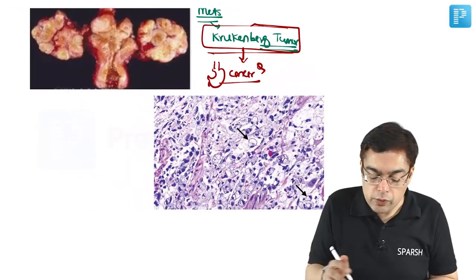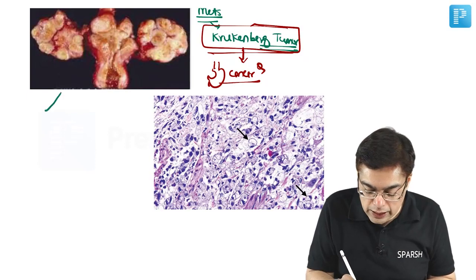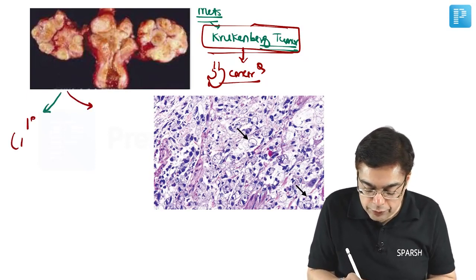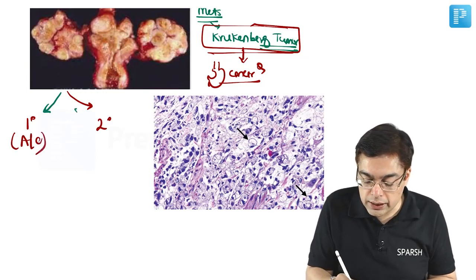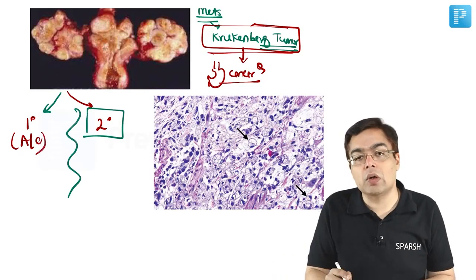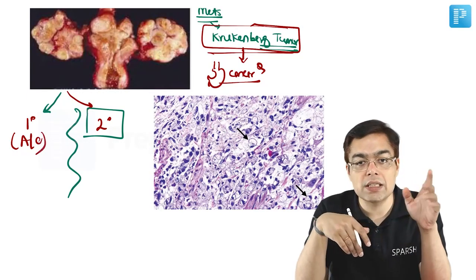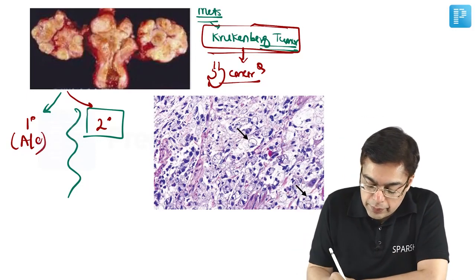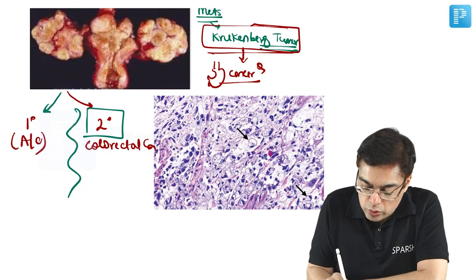An important query which is sometimes posed, I mean that is something which is a challenge to us at times in the lab as well as a common query, is that how would you distinguish whether this is an example of a primary ovarian adenocarcinoma vis-a-vis this is an example of a secondary tumor or a metastatic tumor. So the easiest way would be that we have talked about this particular fact when we talked about the table in which I explained you that we are using currently cytokeratins CK7 and CK20 to identify the carcinoma of an unknown primary. What we have over here is that, let me take the example of a patient who is having secondary ovarian enlargement because of a colorectal carcinoma.